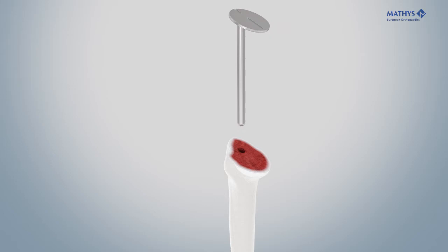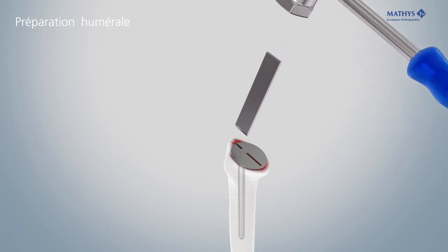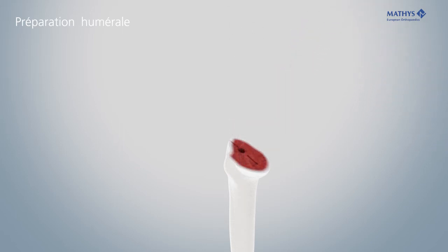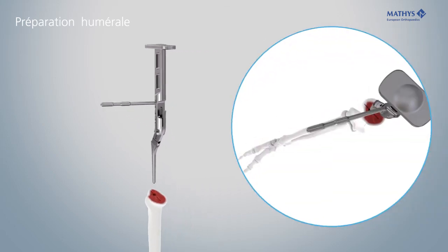Insert the retrotorsion guide and use the lateral and medial slots to mark the correct alignment of the rasp. Lock the rasp firmly in the positioner. Screw the alignment rod into the hole corresponding to the desired retroversion. Align the alignment rod parallel with the forearm.